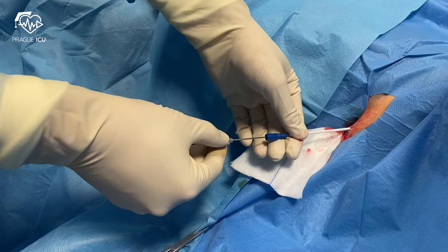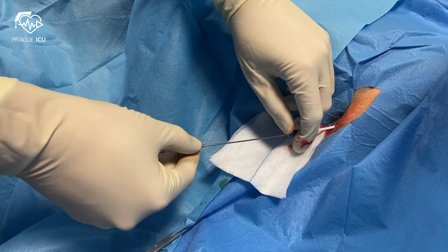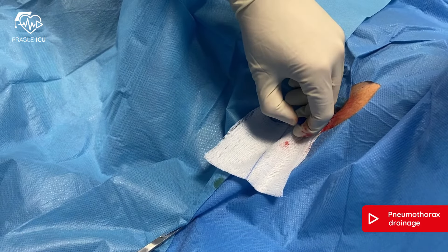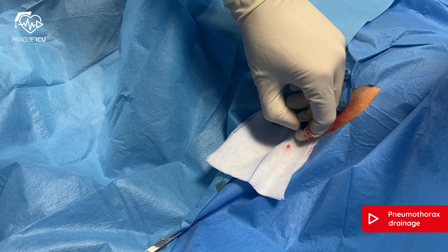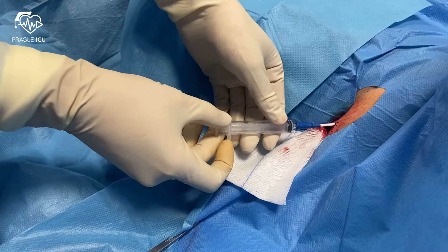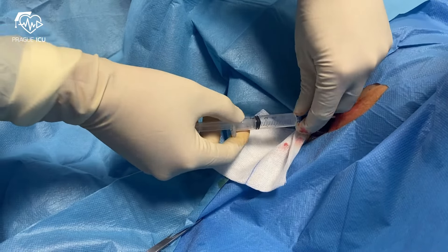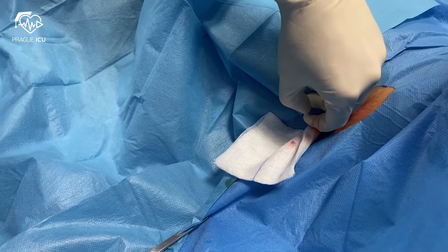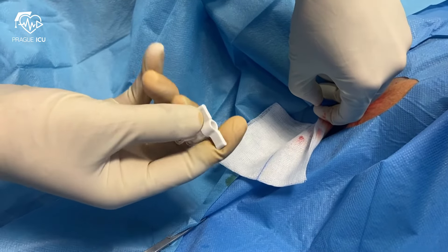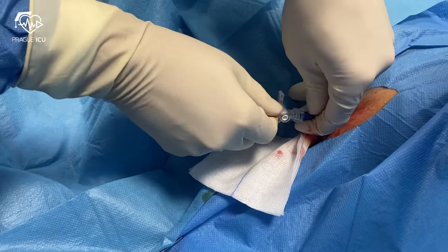Take the sharp stylet out while simultaneously advancing the catheter into the pleural cavity. You can double-check with the syringe that you can easily aspirate the air. Afterwards, attach the closed 3-way stopcock with the connecting tubing and suction system respectively.